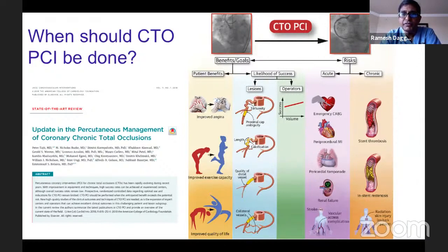The risks as well are emergency bypass surgery, peri-procedural MI, tamponade, which I think is the most common one, and renal failure. As Dr. Bank said, in people with normal kidney function, the maximum dose of contrast could be 600. I think maybe we should try to reduce that as much as possible, because something we don't like is to inject multiple times.